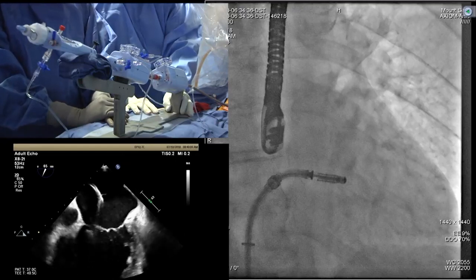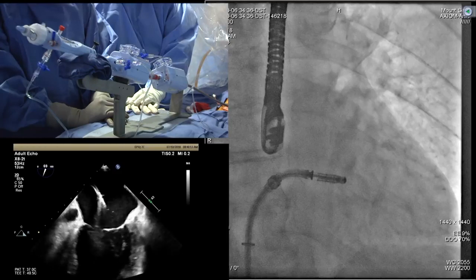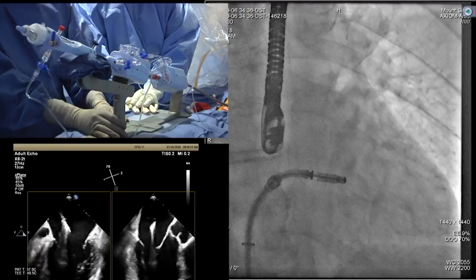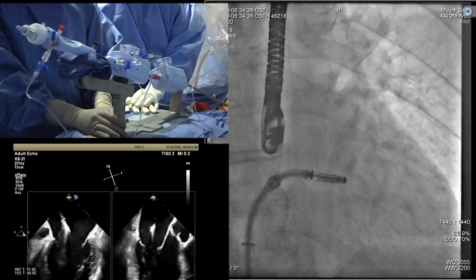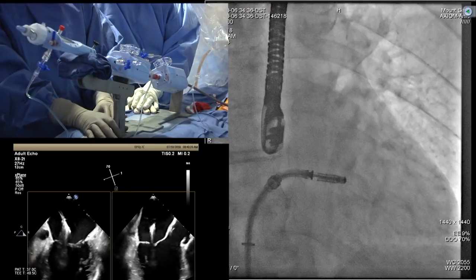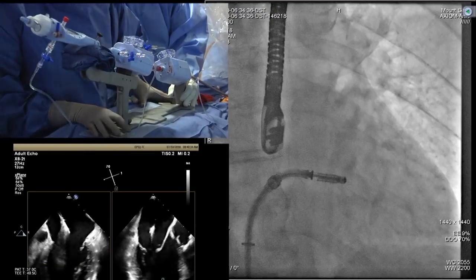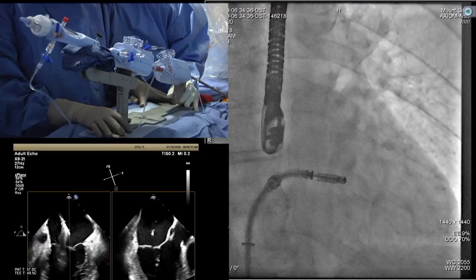We like to use the 3D view also to help guide the posterior movement. All right, Gila, let's do 3D. Not yet, because you have to be in line, right above the valve. We are not above the valve yet. So the question is, do I bring medial? Pull back slightly. Yeah, let's bring the clip closer to the valve.